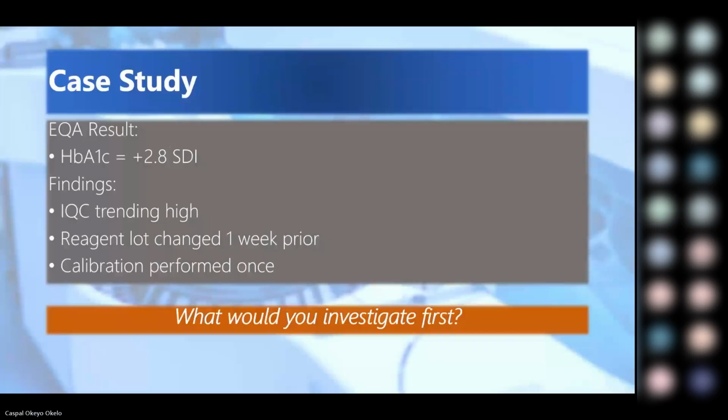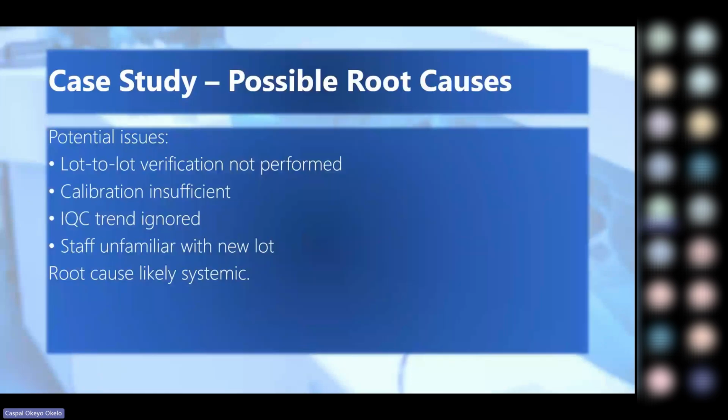So what are you going to investigate first? What should we investigate first? And let me emphasize that a good investigation will always start with data and not assumptions. So to investigate this, we are going to apply the 5 whys analysis.